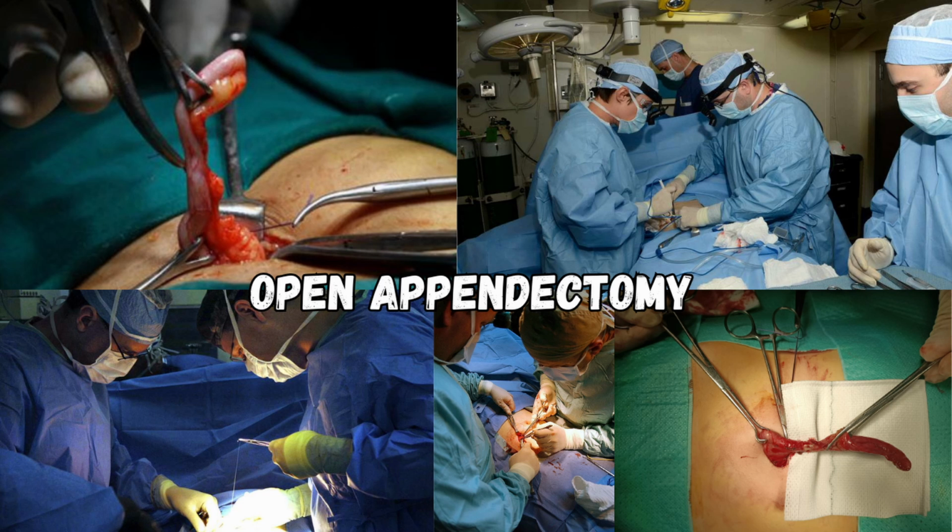Step 5. Locating the appendix. The cecum is located first, often easily identified by the presence of taenia coli, which converge at the base of the appendix. Use Babcock clamps or DeBakey forceps to gently grasp and deliver the appendix into the wound. Avoid using traumatic forceps, which can crush the tissue and lead to perforation.